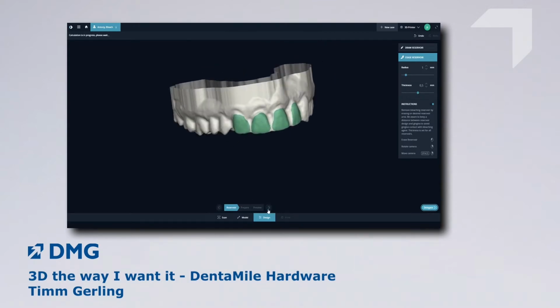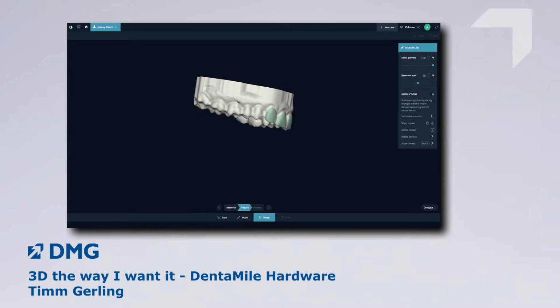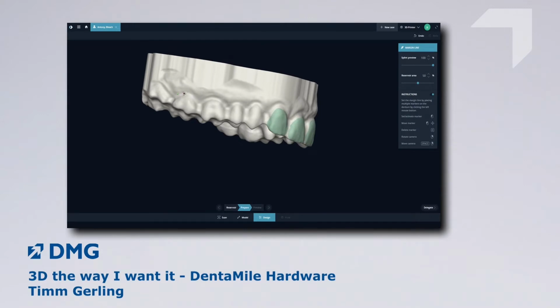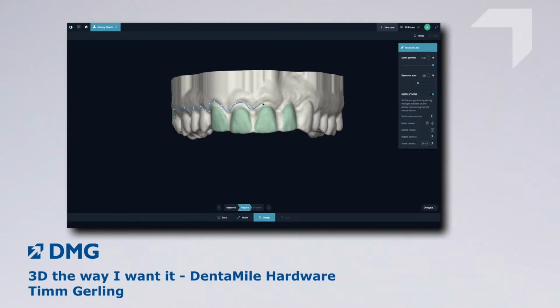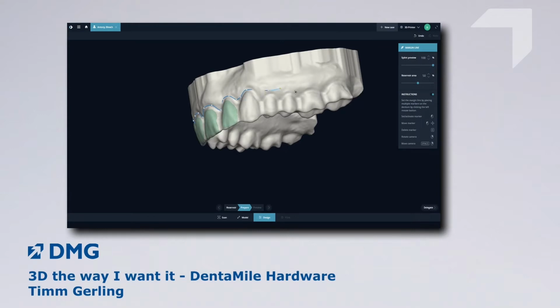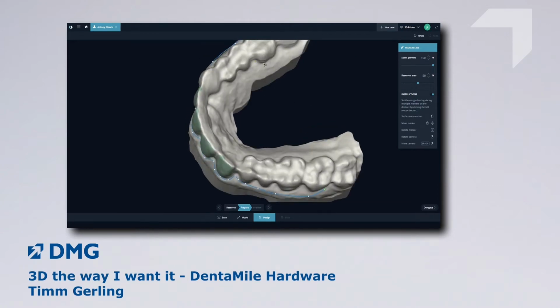And the next workflow step is the definition of the margin line of the bleaching splint. So the margin line design for the bleaching splint can be done very individually. So each dentist or dental technician prefers an individual design, and you can create a margin line like you desire. So in this case, follow the gum line. Then I go into the inner area, to the palate.